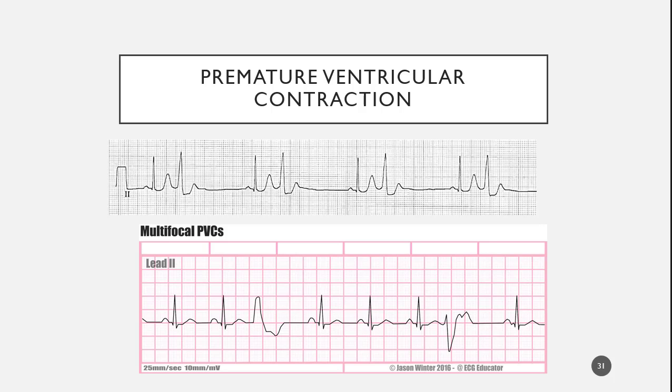When you get that ventricular escape or that junctional escape, you don't have a compensatory pause afterwards. The pause, and it's not compensatory, is in front of it, and the reason the pause is there is because the atria is not doing its job. Is that clear? Very, very good.